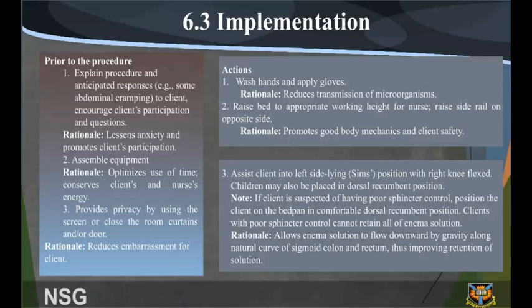Implementation. 1. Prior to the procedure, explain process and anticipated response, for example, some abdominal cramping, to clients and encourage clients' participation and questions. Lessens anxiety and promotes client participation. 2. Assemble equipment. Rationale: optimizes use of time, conserves clients' and nurses' energy.